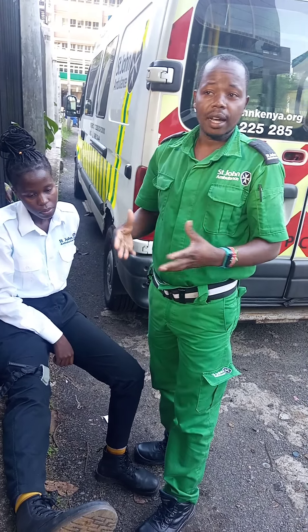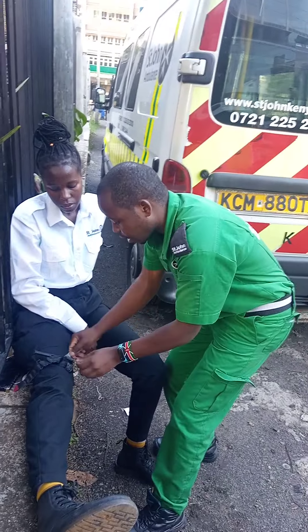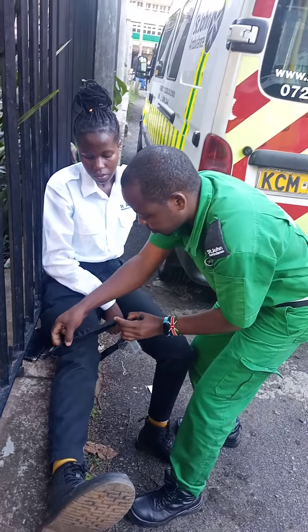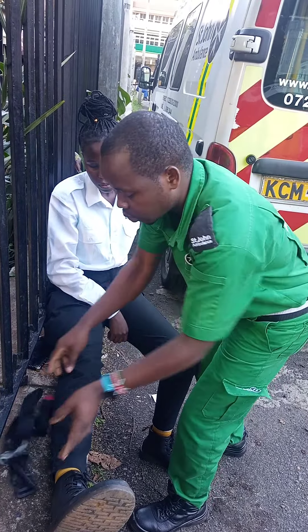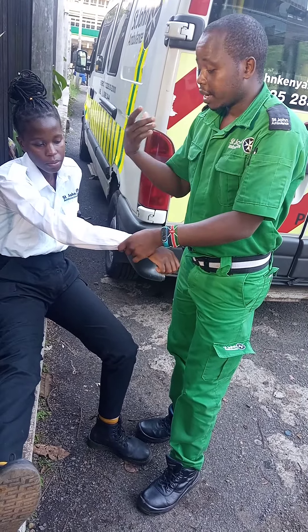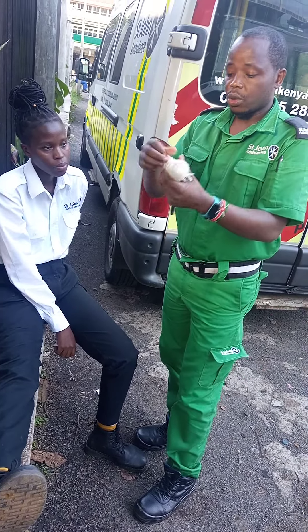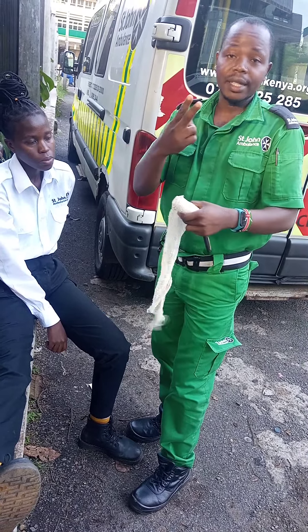But now in the community, how do we improvise a tourniquet? It is very simple. I want to show you how to improvise a tourniquet. This shirt can be used to improvise a tourniquet, or a tie — you can just use it. Or rather use a crepe bandage, for example this one. Come with a material like this one, at least two inches wide.